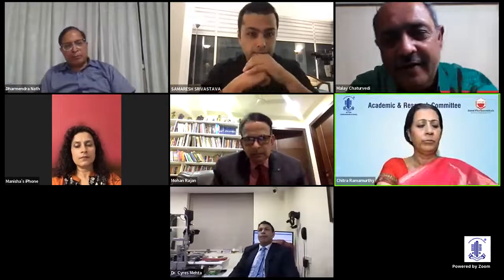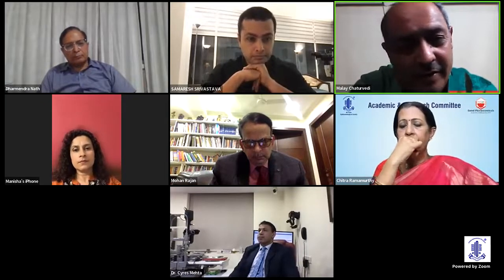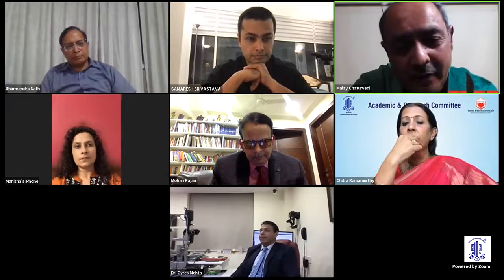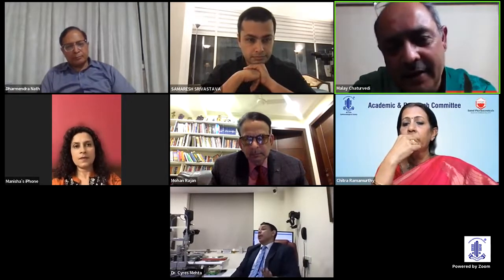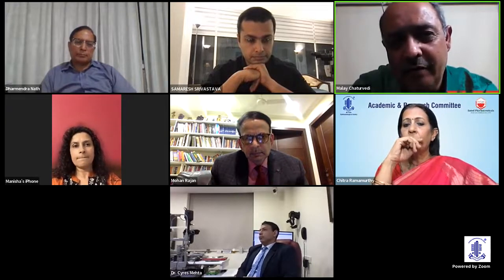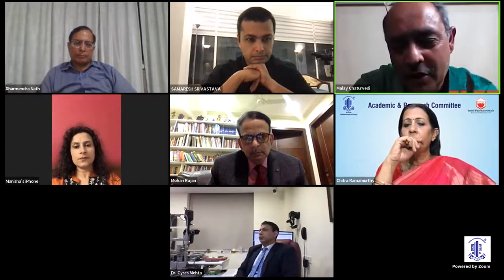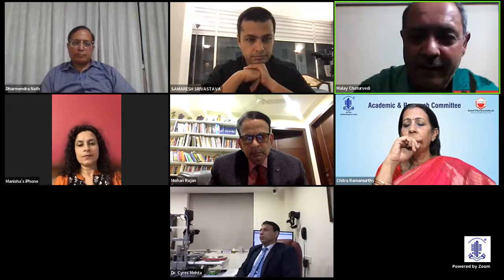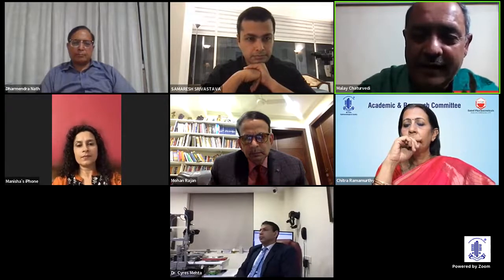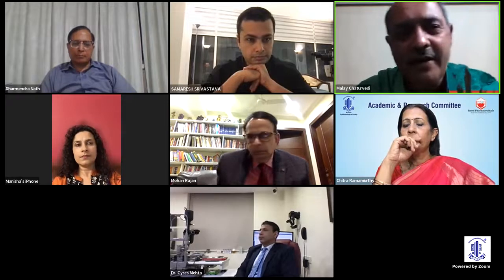Dr. Rajan, there is one more point I want to add. Yes. When you are doing the last part and you're worried about removing the irrigation port and chamber collapse, once the eye is vitrectomized, what we do in fluid-gas exchange in retina surgery, we can do the same thing in the anterior part also. So you put an air bubble and that air bubble takes care of the space and the eye does not collapse. I have tried it many times.